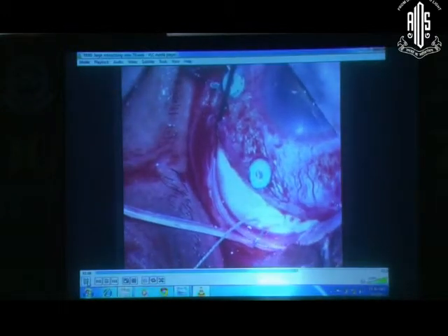And now you see that I made a retinectomy, but it definitely seems to be going out of hand in that sense, because the traction is spanning through and through from superior to inferior, and slowly I make radial nicks to reduce the amount which is going posteriorly. But you can see that the posterior part of the lip of the retinectomy instantly starts to retract and goes more and more posterior, and this is something we face sometimes with even PVR cases. This is of a PDR based pathology which has gone on to that.